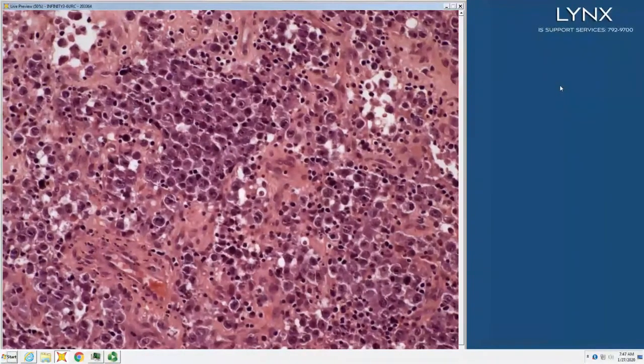Here you've got big, round cells, lots of mitotic figures, lots of centrally placed nucleoli. This is a nasty blastic lymphoma. Sort of thing you might see on the leg of an older person.